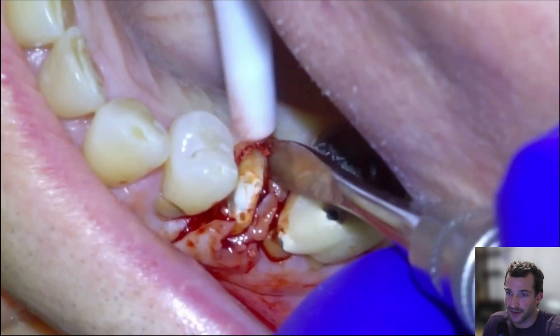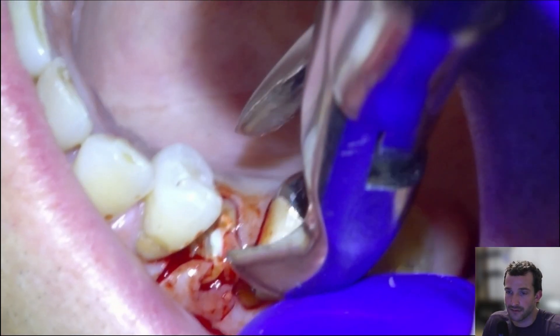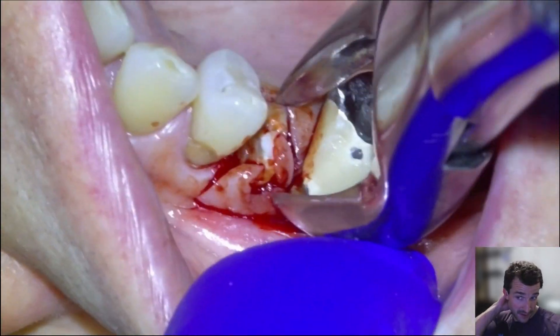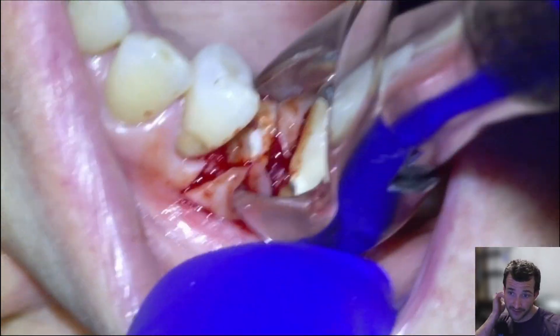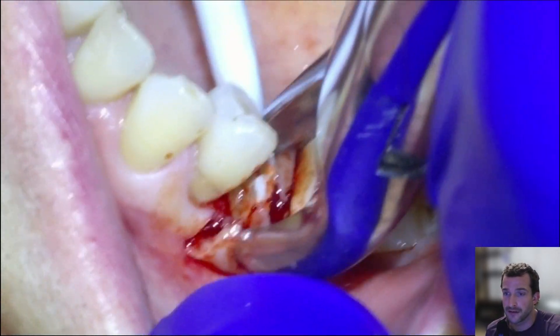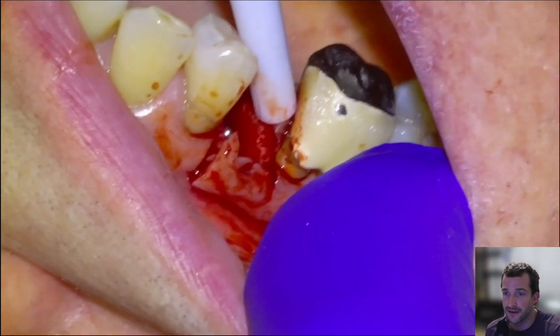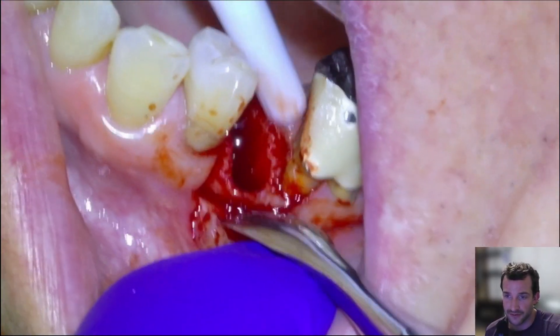We'll do a little envelope on the lingual surface, keep elevating with the periosteal, and then once we have some decent luxation on it, we're just going to grab it with some forceps. Nice and easy until the root comes out — it comes out nice and easy, really only one conical single root.